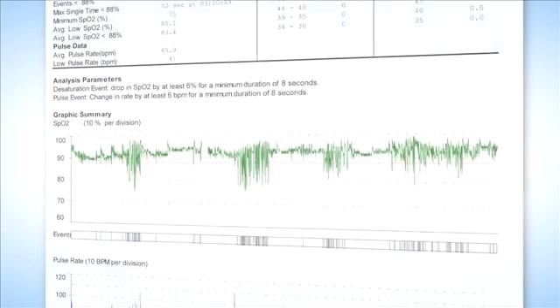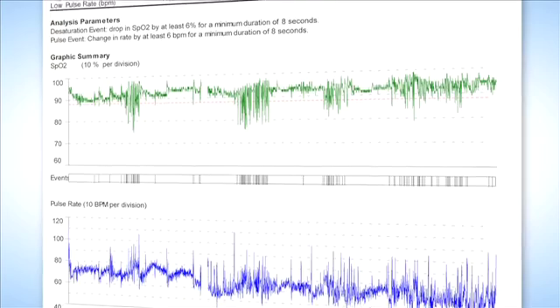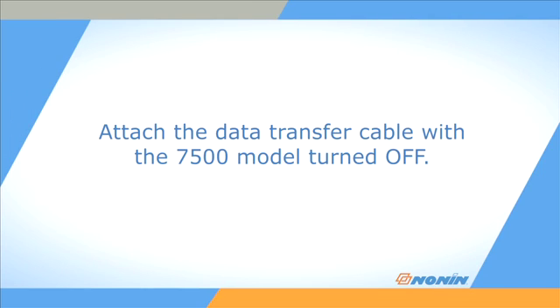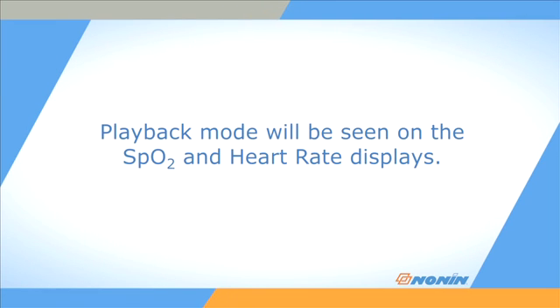You can download the measurement data in the oximeter to Nonin's Envision software for storage and analysis. To download the 70-hour memory from the oximeter, attach the appropriate cable or data collection drive from Nonin Medical with the 7500 model turned off. Press the plus button and the on-off button, then release the plus button. Playback mode will be seen on the SpO2 and heart rate displays until the data transfer is complete, after which the oximeter will return to its normal function screens.